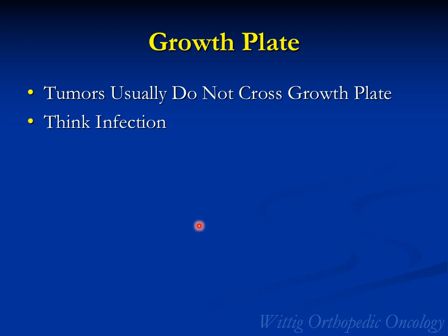Some important points to remember: tumors usually do not cross the growth plate. Rarely they do, but if you see a lesion that crosses the growth plate, you have to think of an infection.